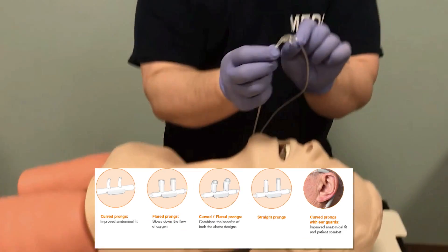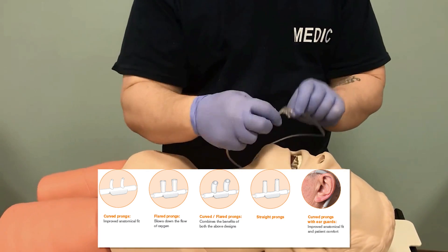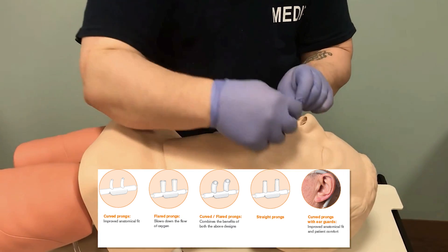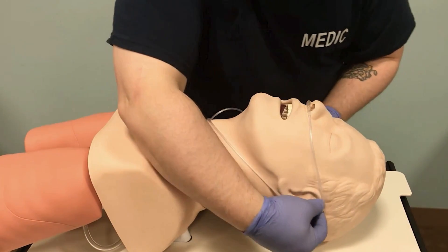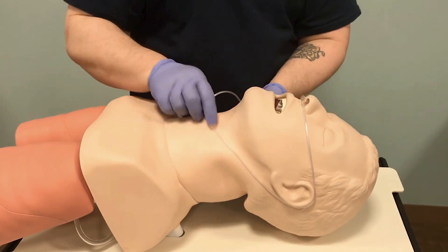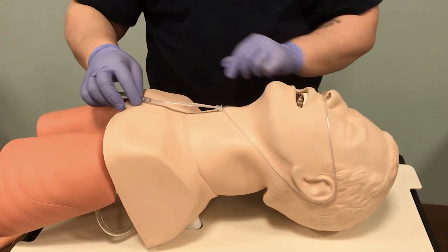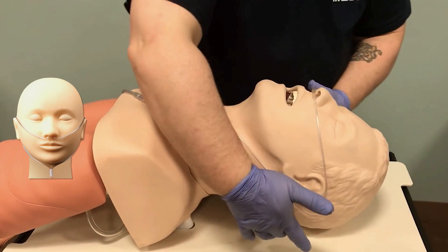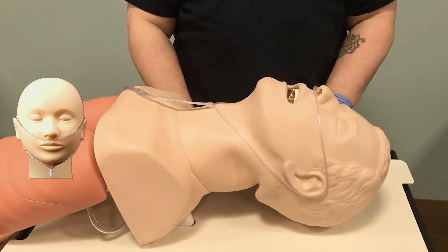When positioning the cannula, the prongs curve to follow the natural anatomy of the nose and sit right in the nares. The tubing comes over the ears — our mannequin isn't making that easy — and then cinches right up under the chin. So it goes around the ears, cinches under the chin, and is attached to the oxygen supply.